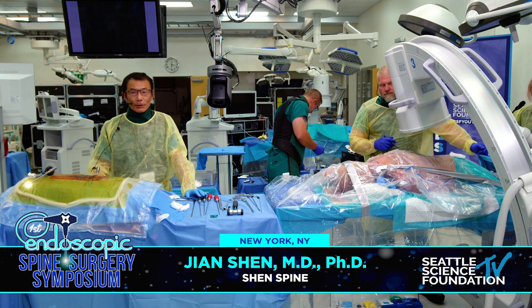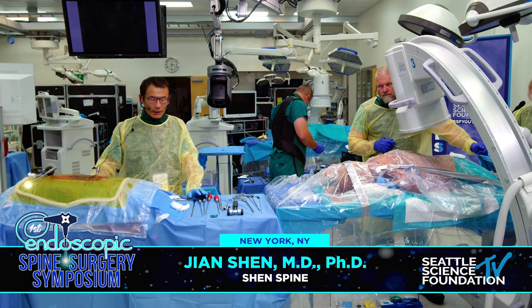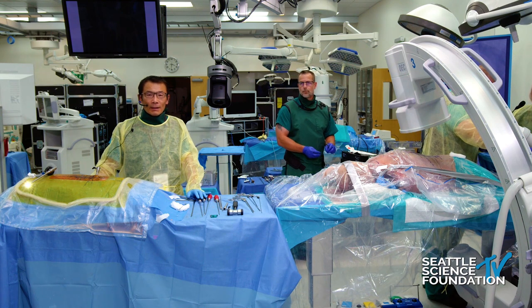So let's go right to the endoscopic fusion. To me, there are three goals of endoscopic spinal fusion. First one is no harm. So safety, that's number one. Number two, you want to achieve good fusion.